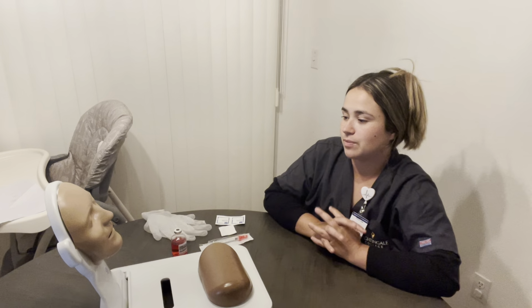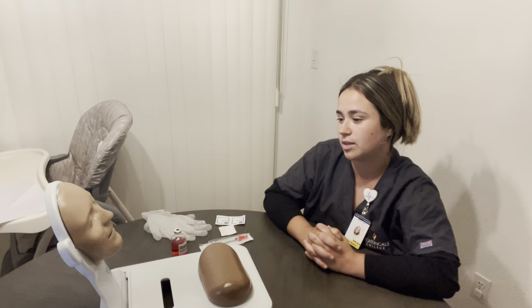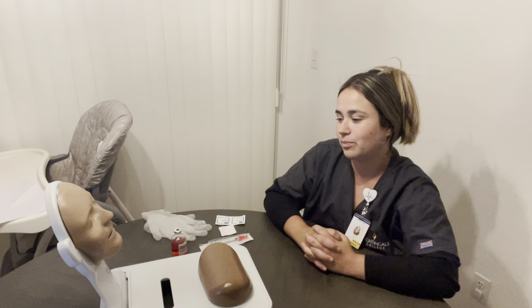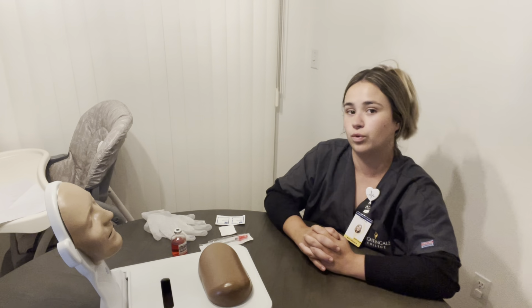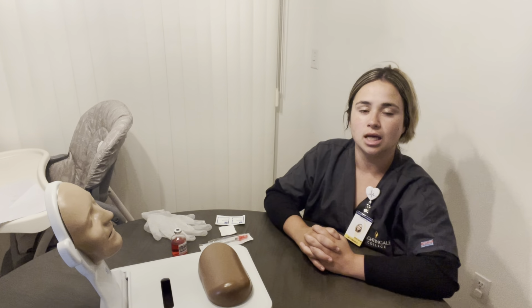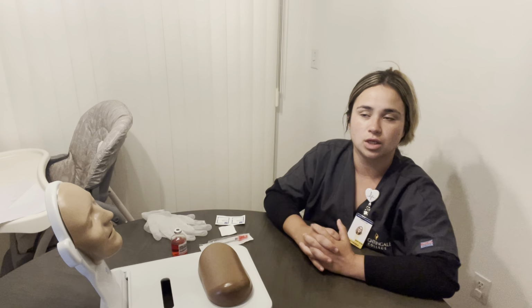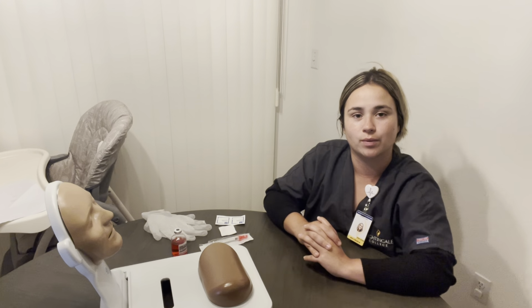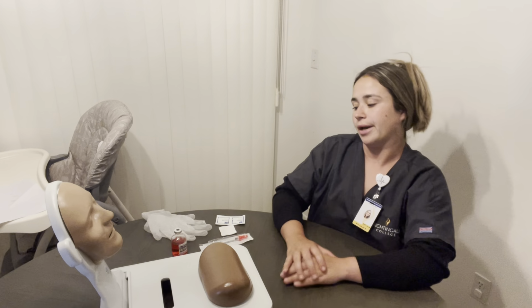So, hello, Miss Smith. I'm going to be your nurse today. Can you please verify your name and date of birth? Okay, perfect. This would be a good time to verify the information that they gave us with the order and the medication, just to make sure, again, like I said, to lower the risk of any errors. So we want to make sure that we're double checking on that.